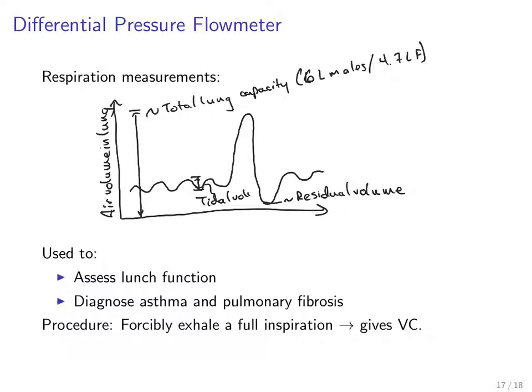This is a large inhalation. And the biggest change, that is the distance between the maximum volume and the residual volume, is called the vital capacity.